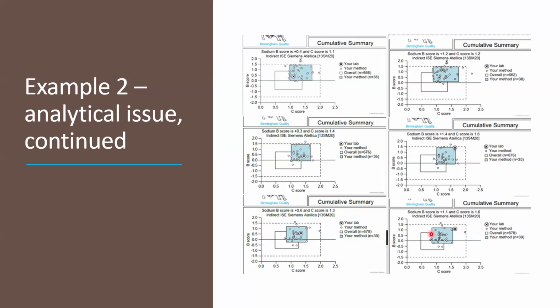and it's the same for the later distribution, some 10 distributions later. However, for line 2, when the issue was resolved, we are within the acceptance limit. However, as the issue was persisting, we can see that our lab is outside of our method group and also the overall method, which implies that the problem has been persisting, and it requires action and resolution.